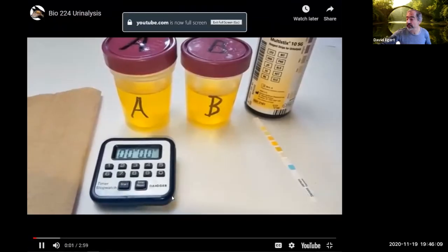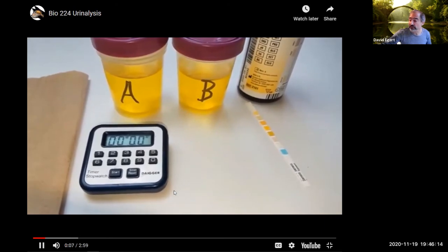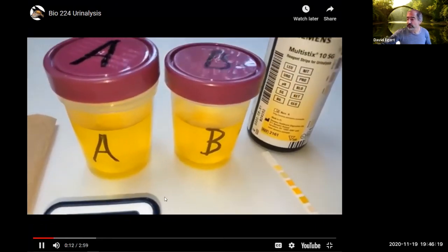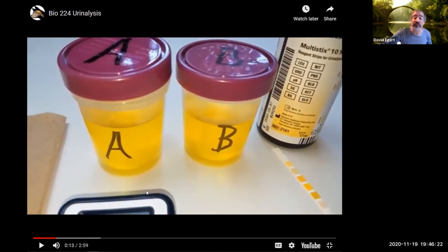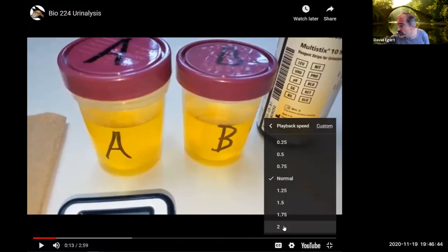This video is going to cover part 2 of the urinalysis lab, evaluate the unknown samples. So here we have 2 urine samples. These are different from the A and B above. Before you get the data, you want to write a chart in your lab book already, with glucose, bilirubin and so on, so you're ready. As she's going, rather than sit through it all, I'll just show you fast so you can just see it.